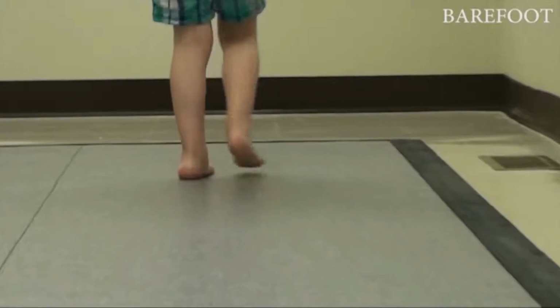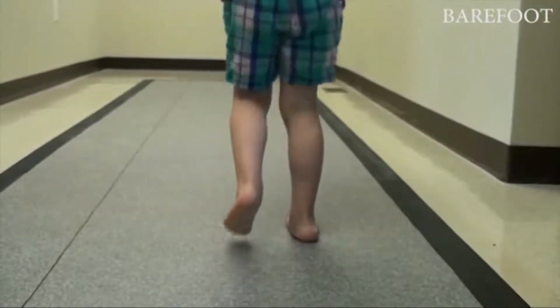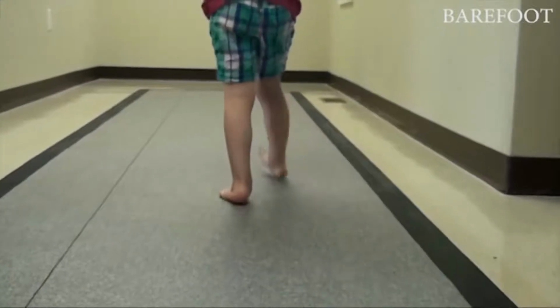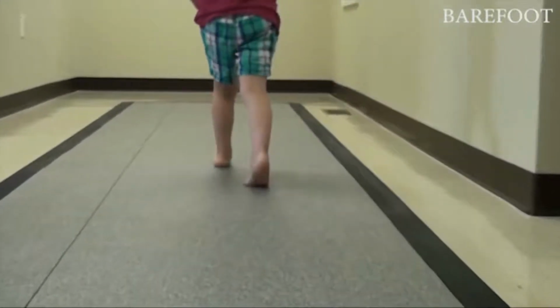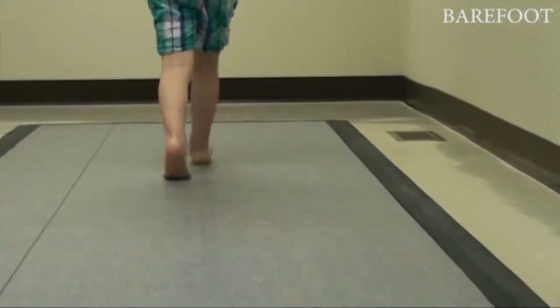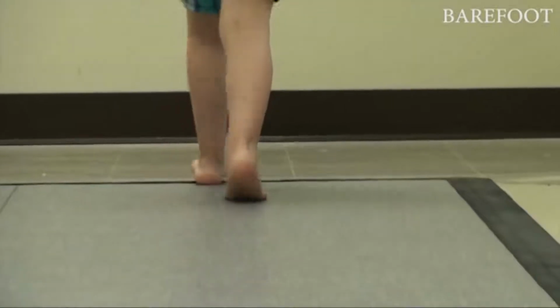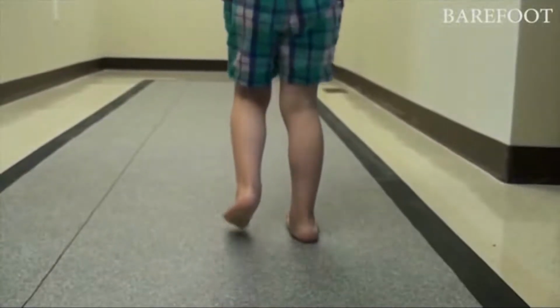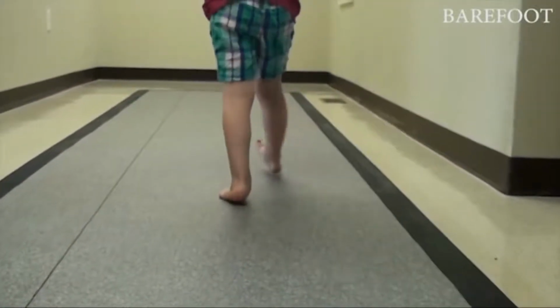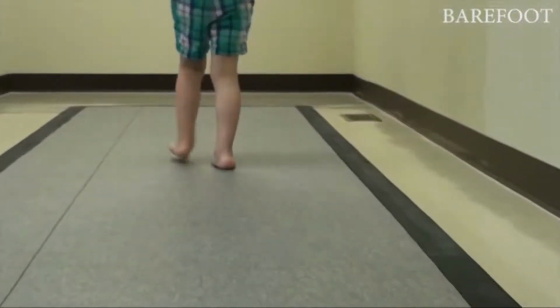Here, as we look at the pronated foot at ambulation, we can see that the valgus position continues to stay constant through all phases of gait. Over time, this will lead to contractures of the peroneals and the heel cord. As we watch this gait pattern, notice that even during the swing phase, he never pulls out of pronation at any time during the gait cycle.